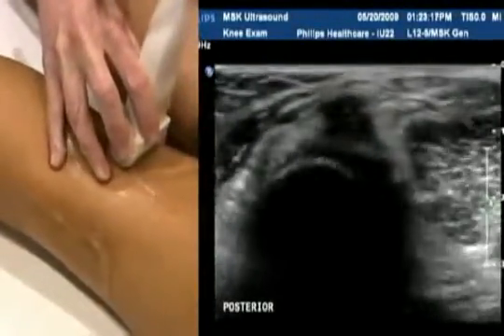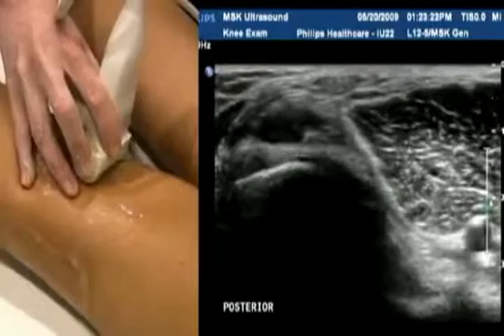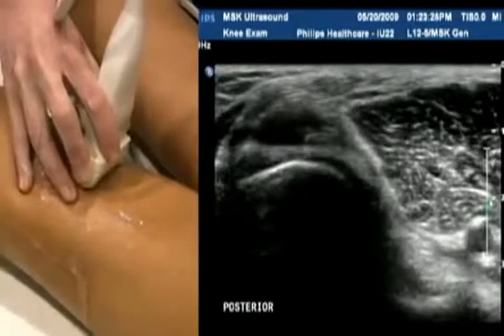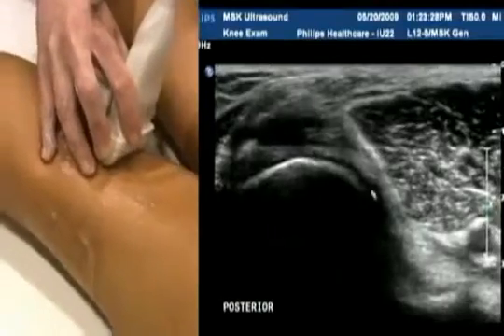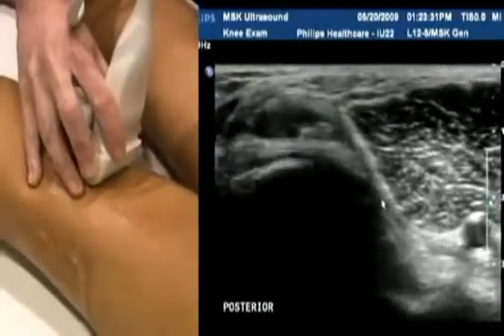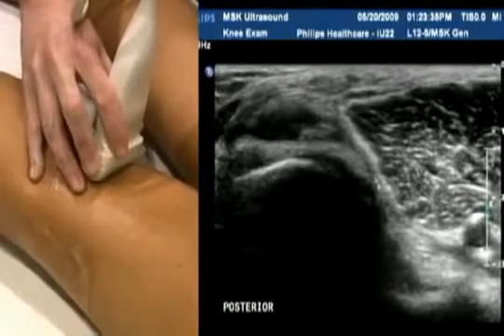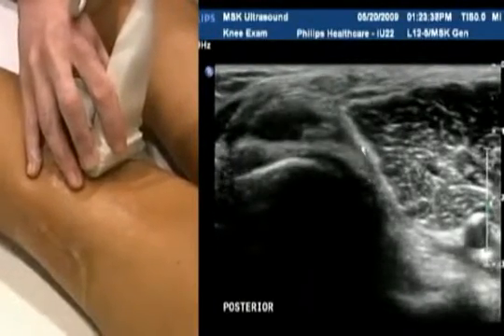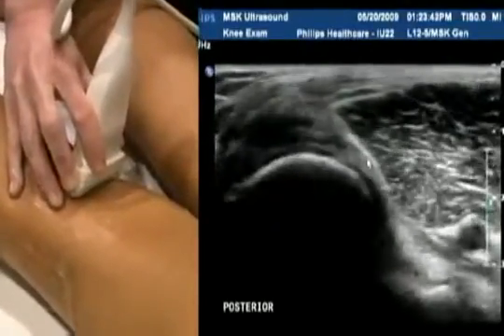A Baker's cyst is going to appear medially in the popliteal fossa, lying between the semimembranosus and the medial gastroc muscles at the back. Our patient here doesn't have a Baker's cyst, but you can see it would rise from this portion of the popliteal fossa and surround the medial gastroc muscle distally.